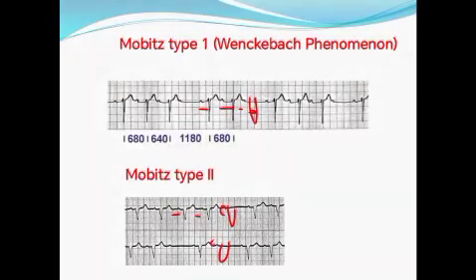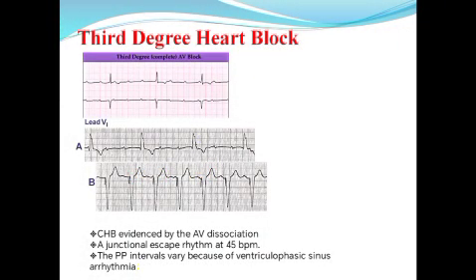Okay, what about third degree heart block? Third degree heart block is also called complete heart block.